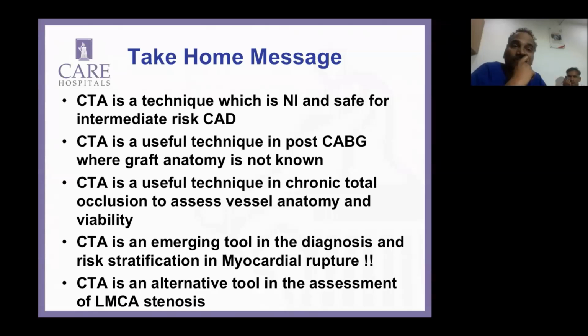Yeah, I think that's a very important point, and I'll be happy to work with many of you to get over the initial stages so that you're comfortable looking at CTs and with basic interpretation. Once you start doing these interventions with the CT data in front of you, and we have cath labs now where you can superimpose CT data, I think it's going to be a very useful tool for us.